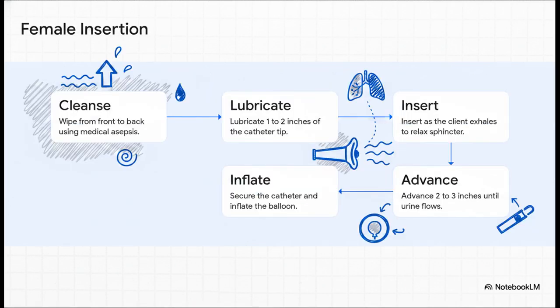Let's zoom in on the female-specific insertion technique. When you're cleansing the meatus with antiseptic, you absolutely must wipe from front to back. Always move from the least contaminated area to the most contaminated area. That's just basic medical asepsis principles at work.